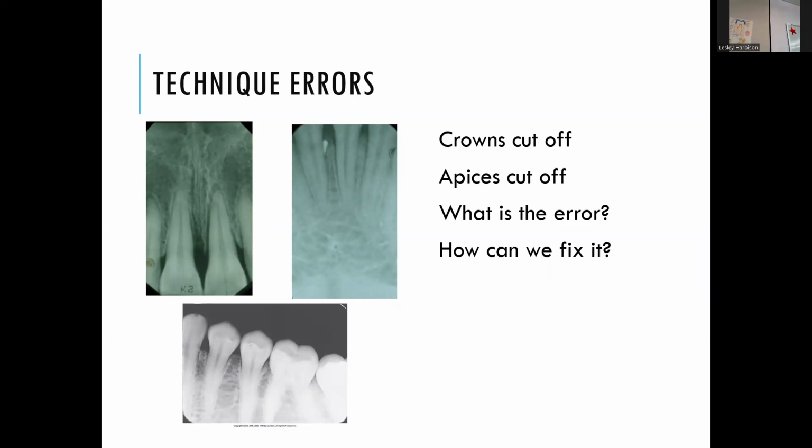Yeah, that's almost always they're not biting down hard enough. A lot of times when we're first getting used to taking pictures in somebody's mouth, we just put it in there and it hangs off of their face. And we're just like, oh, see, that looks good. But the biggest trick is that when you put it in their mouth, you seat it all the way down. Don't wait for them to bite.